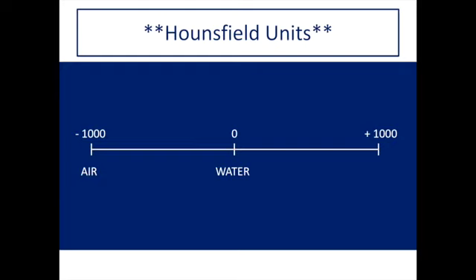The basic radiographic densities are extremely important to know. Again, -1,000 is air and 0 is water by convention. If we add something to the water like red blood cells, the density is going to get a little bit higher than that. Things that are very, very dense like cortical bone or metal are near +1,000. Soft tissue like liver and muscle will depend on the particular soft tissue. But for simplicity's sake, we're going to use a ballpark number that's easy to remember, +50.